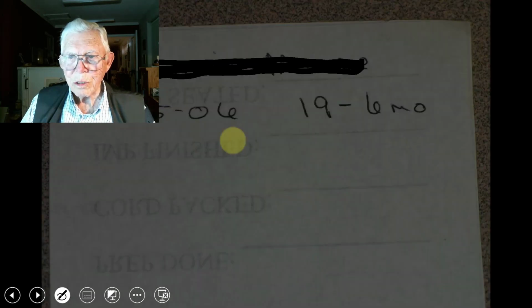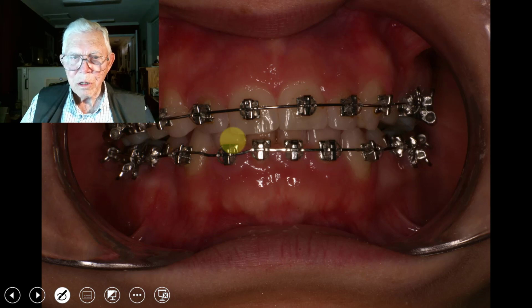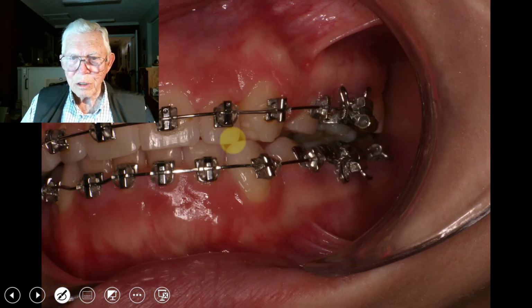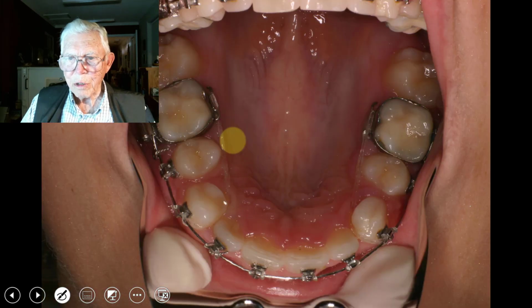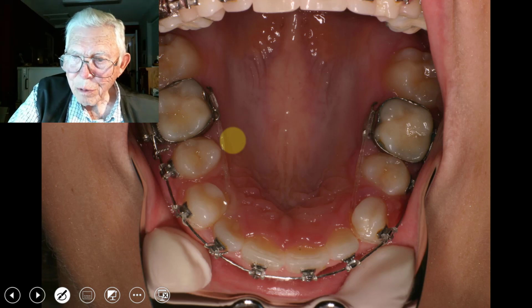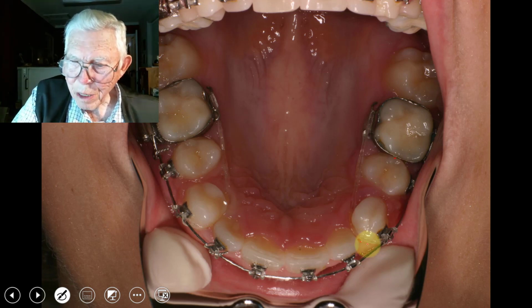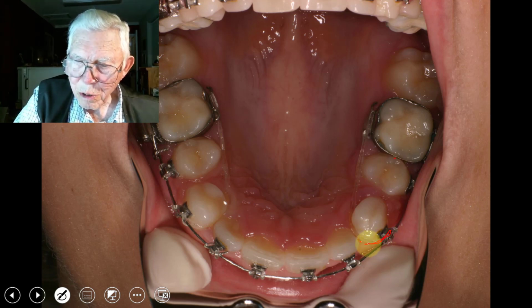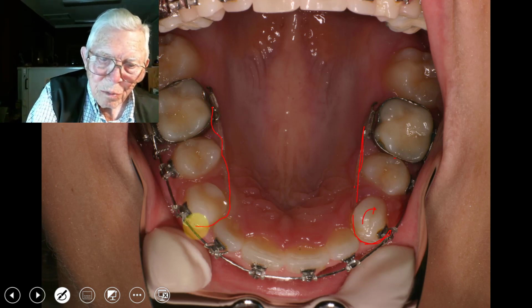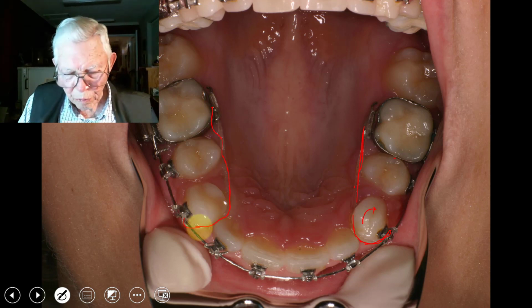And this was 19, and here it is in the braces, and we're finishing this out, so it's just regular orthodontics. There's one thing here, I'm rotating, I'm pulling this space together and coming around hooking this too. So we'll rotate that tooth a little bit by this elastic chain, and we're doing a little bit of the same thing on that one. On the other side, I'll just point those out.